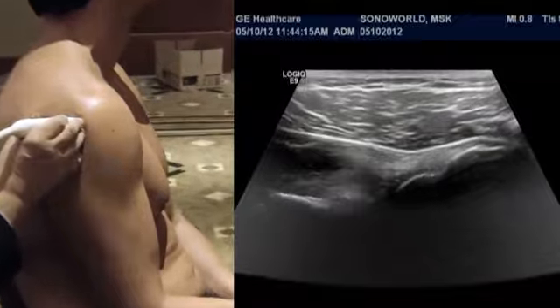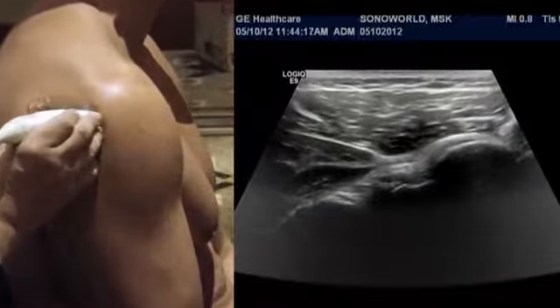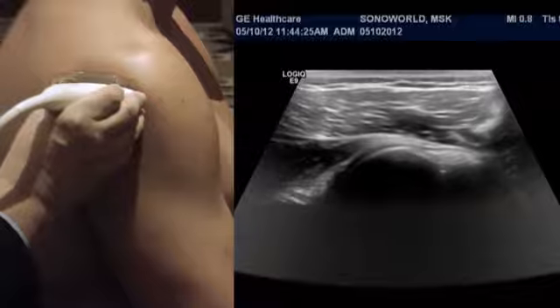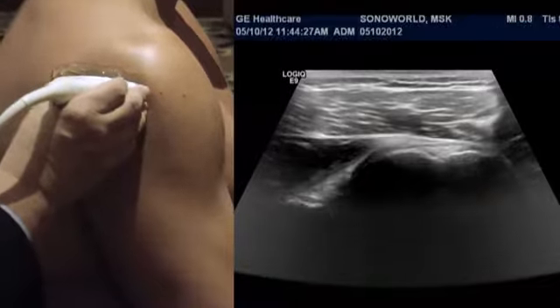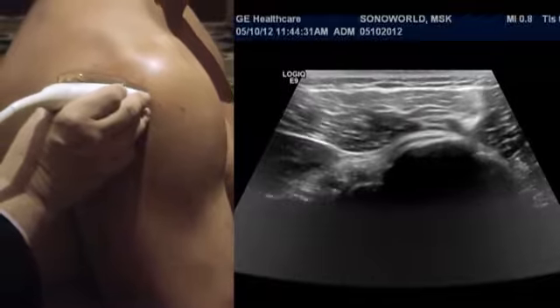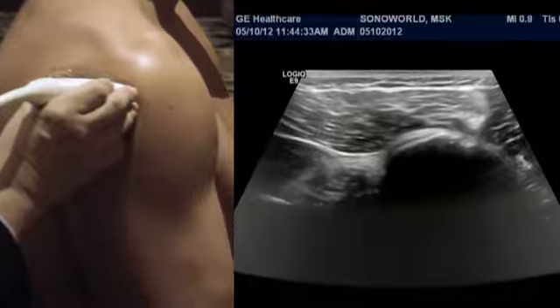Here you see that the apex is mildly indenting, but that's about all that's happening in this professional model. The second thing you're going to look for is the normal variant bare area of the shoulder and see if it is deepened or widened.